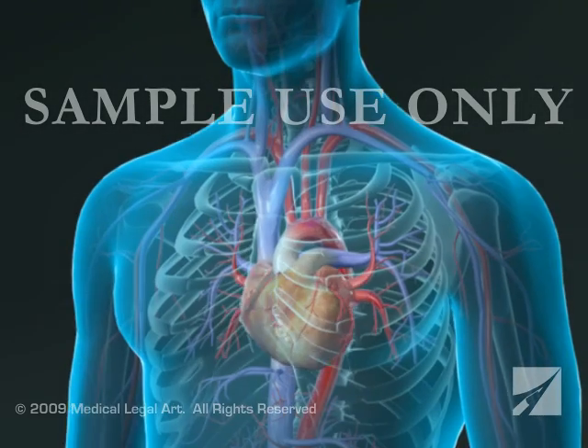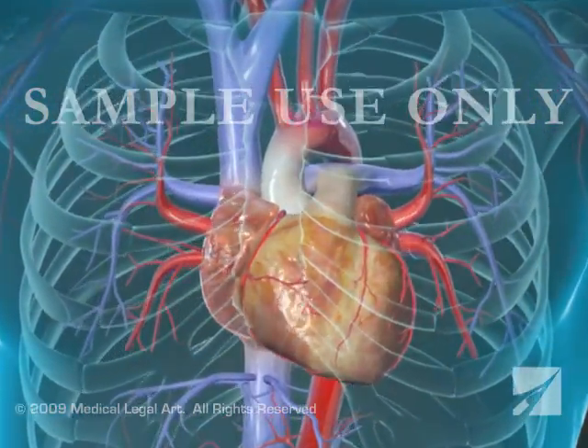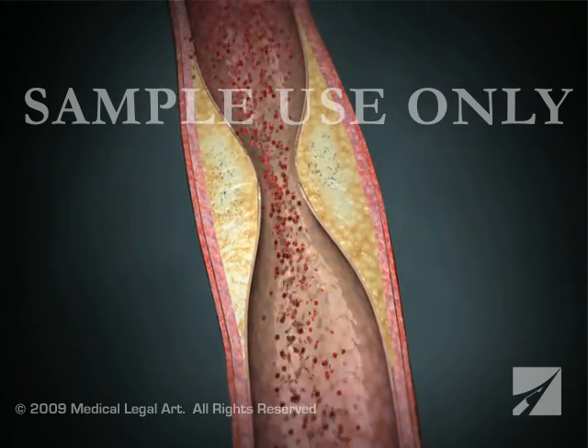A coronary artery bypass graft, or CABG, is performed to improve circulation to the heart muscle in people with severe coronary artery disease.